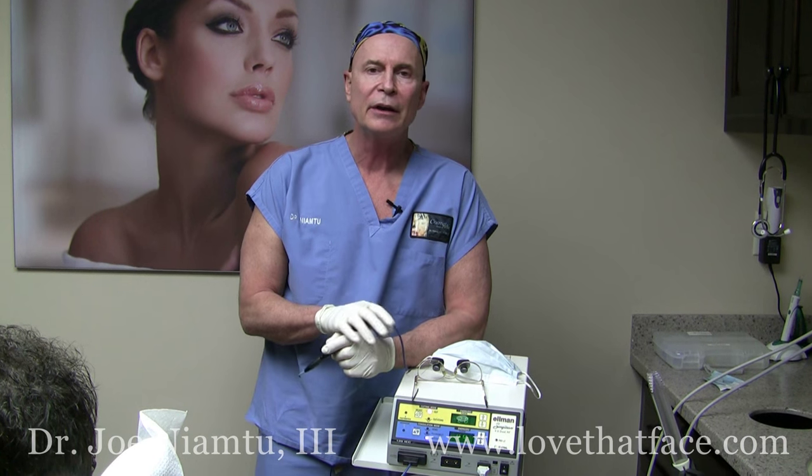I'm Dr. Joe from lovethatface.com and today we're going to take off some DPNs, which are very common benign little skin tags frequently seen on African American patients. We're going to use the Elman radio wave surgery, which is one of my favorite ways of doing this. We also use the 532 or the 940 laser.